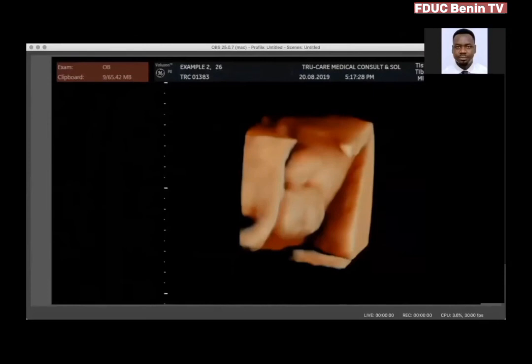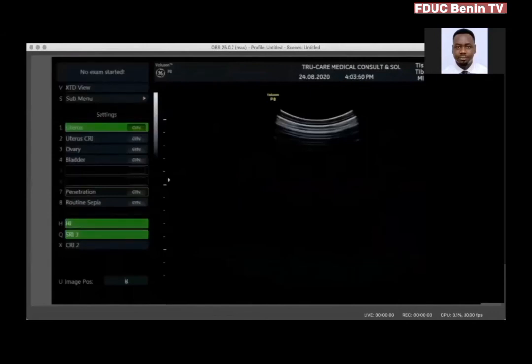So you're welcome, Mom. Please come and lie down here. You're welcome. Let me have one of the towels here. Are you comfortable? Please go up. And then have this pillow. Okay. So just make sure you're very, very comfortable. Thank you. Okay. So how many weeks now? 33? It's 32 weeks. Okay.